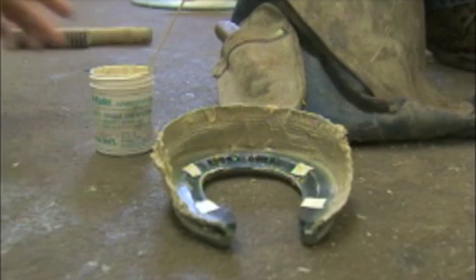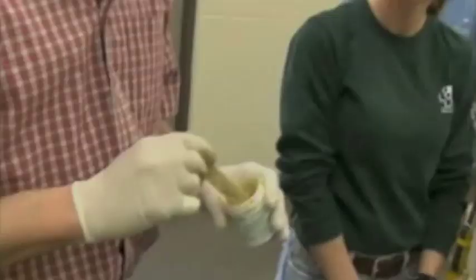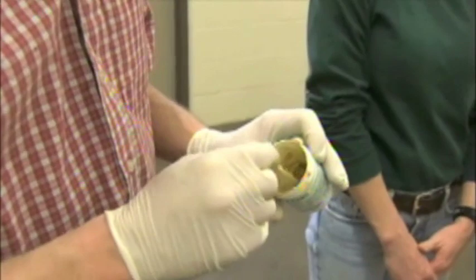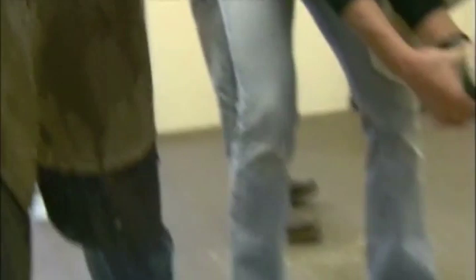Now she's putting the glue on the cuff. I'll take some and put it on the hoof wall - just smear it on the whole outer surface of the hoof wall. I usually wait - I'm not in a big rush to get this on the foot. I wait for the glue to get a little tacky, to begin setting up. When it gets a little tacky, then I'll put it on the foot. I wait until the glue starts changing color, gets a little greener look to it, a little more tacky and stiff. That's about when I'd go on and glue the shoe on. Once the glue is tacky, we'll place the shoe on the foot.